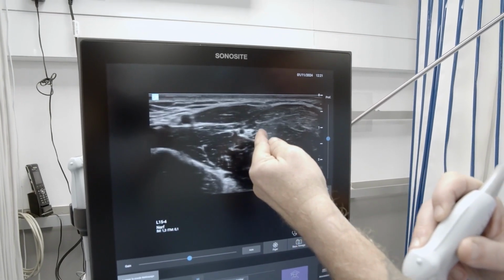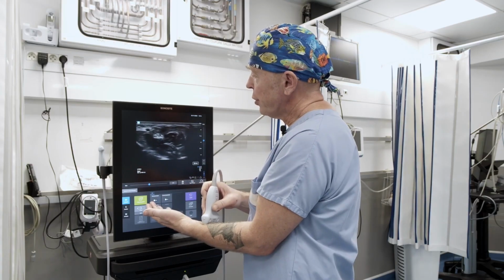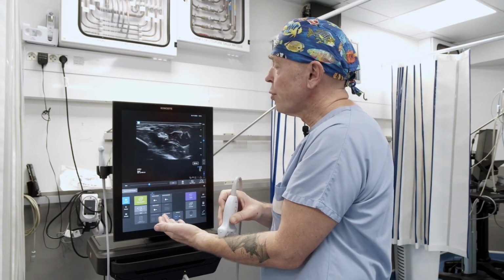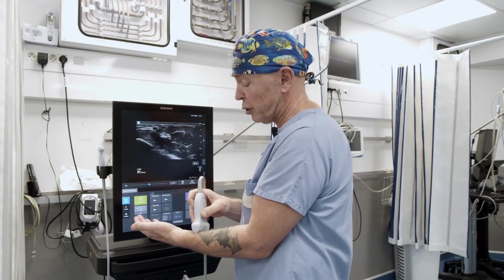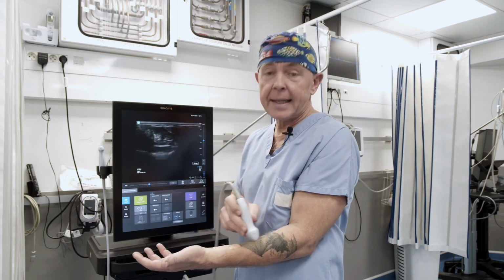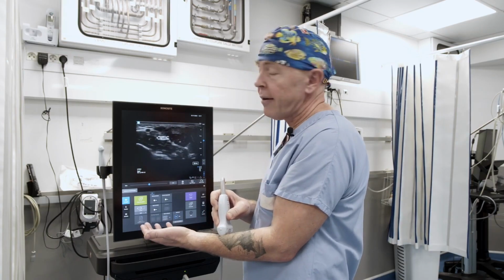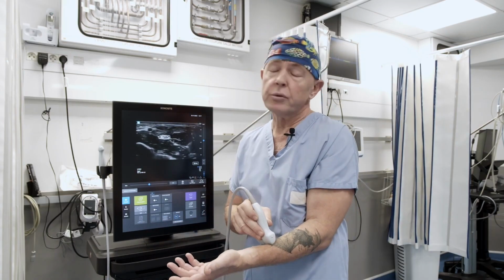Subsequently, you accurately position it in the correct manner. Occasionally, you may even need to bring it slightly nearer to the edge of the screen to achieve a more concise needle path. Most importantly, in the practice of ultrasound, the essential aspect is to be capable of following it proficiently. This will enable you to differentiate between fascia or tendons on certain occasions.